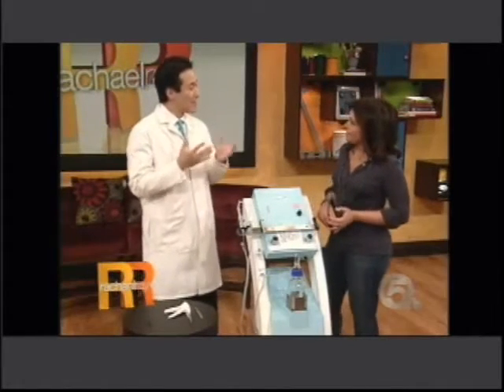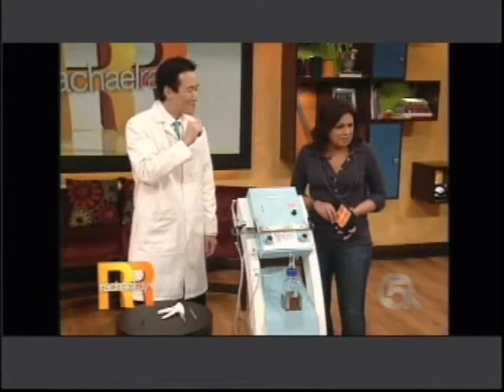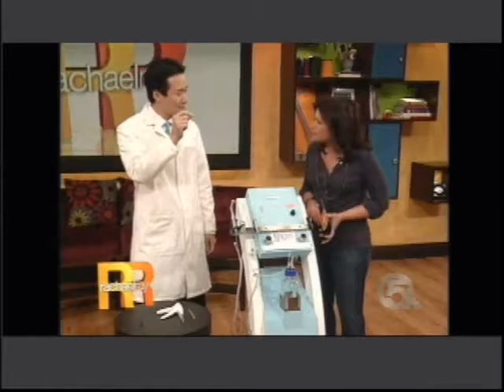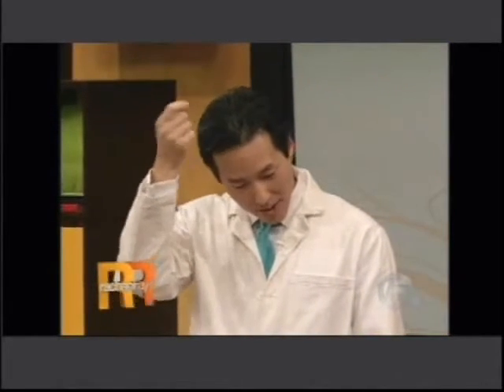Right. The third step is we have a team of assistants that literally take that strip of hair and whittle it down into each individual hair follicle, thousands of hair follicles. So it's a team of assistants, and it's very tedious. Fourth step is I take a big needle, and we take a look at the bald part that we're doing, and literally poke thousands of little holes into the bald area. And the last step is take each individual hair follicle, grab a tweezer like this, and plant it into each little hole. And that's hair transplant surgery.